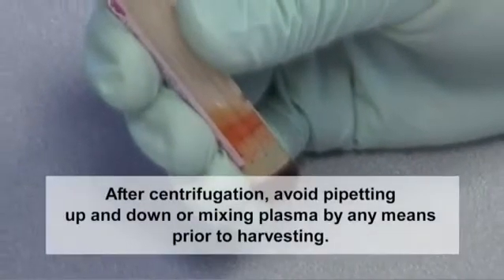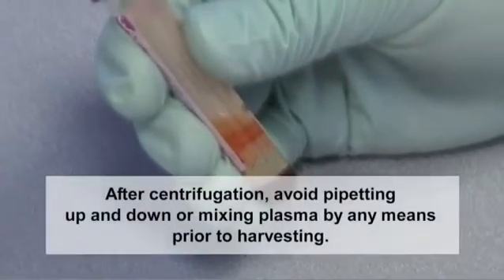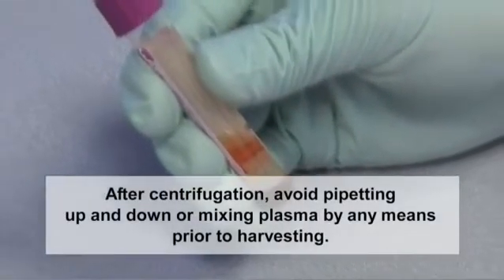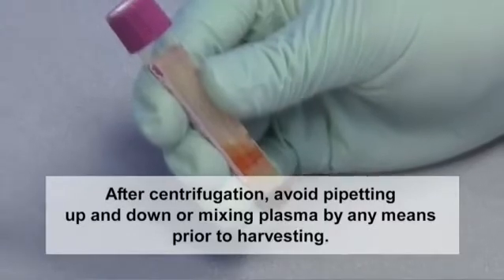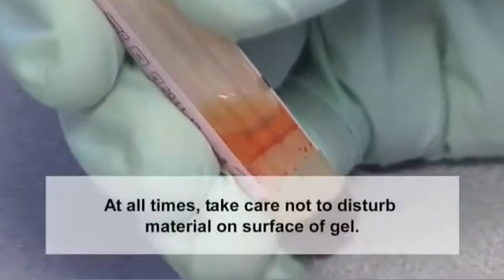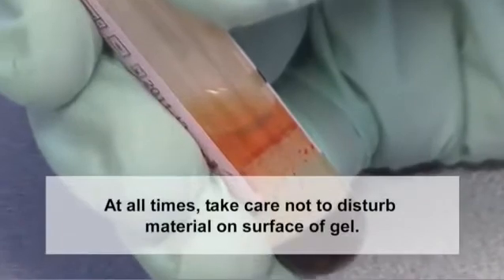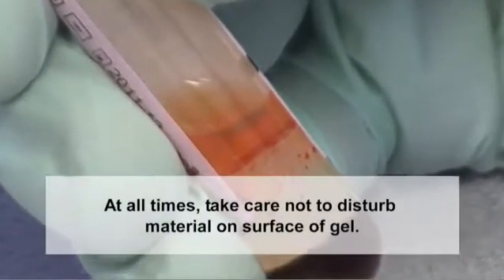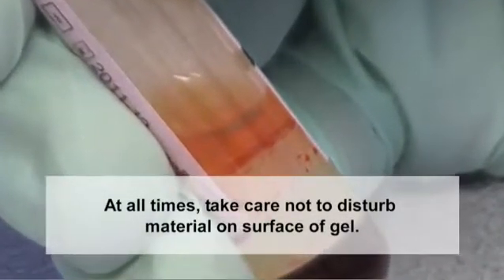After centrifugation, avoid pipetting up and down or mixing plasma by any means prior to harvesting. At all times, take care not to disturb material on the surface of the gel.